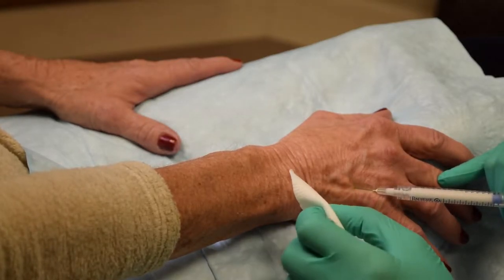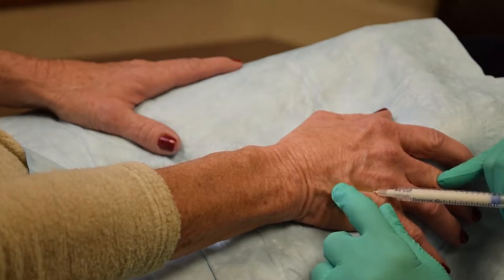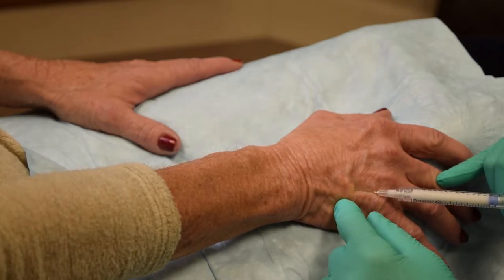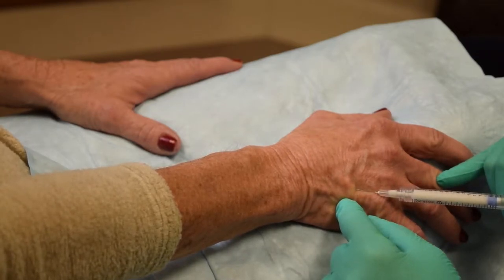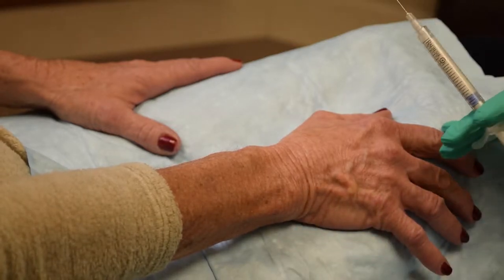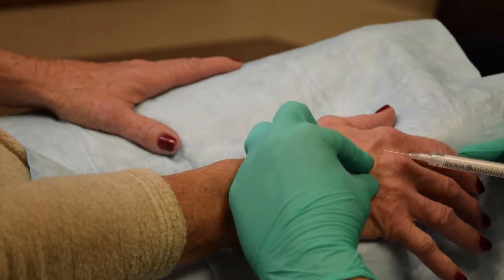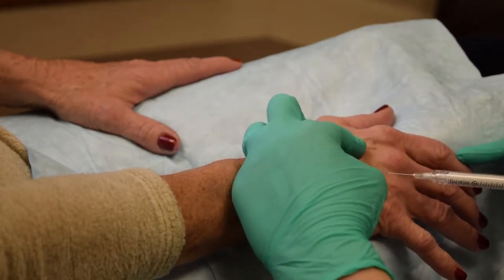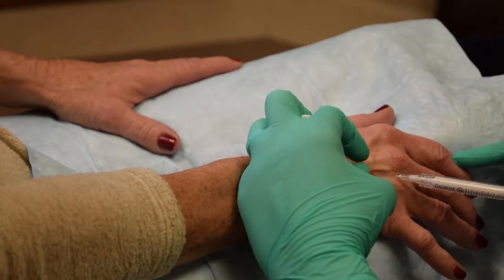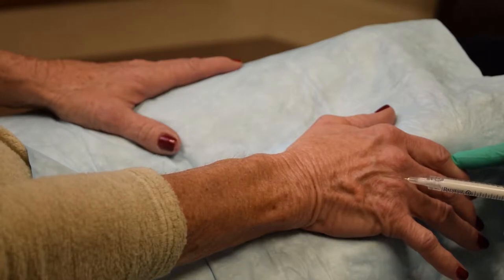The calcium hydroxyapatite injectable is an opaque, highly viscous gel. Its primary component is synthetic calcium hydroxyapatite. The gel is relatively difficult to extrude — you can see that it requires some force to deliver it in small boluses when using the needle. Off-label mixing of the gel will decrease the viscosity, decrease the force required for injection, and ease product distribution under the skin.